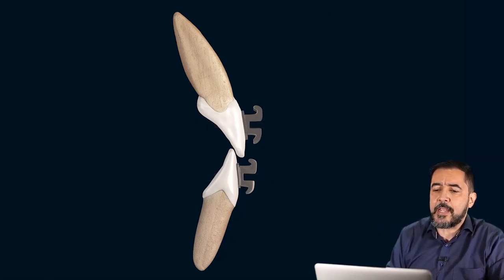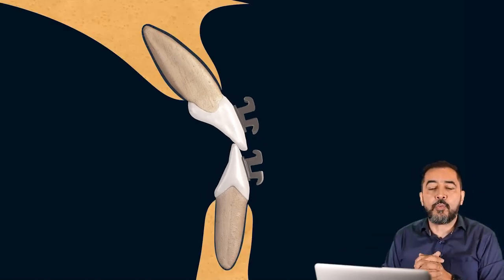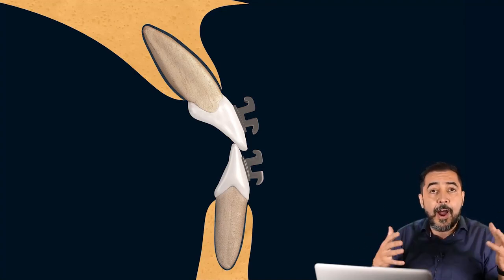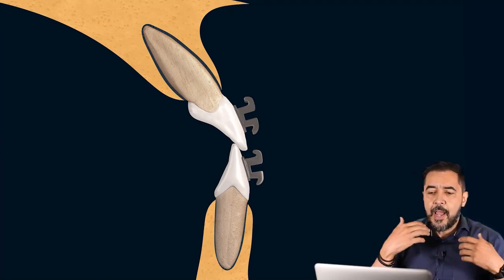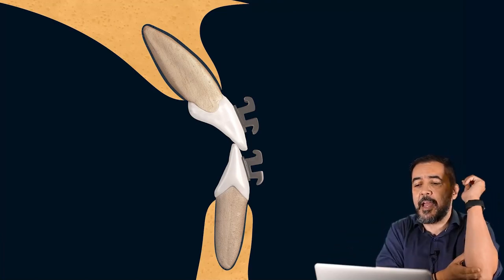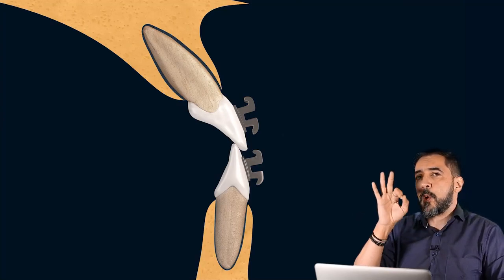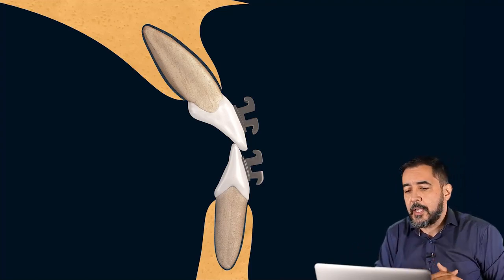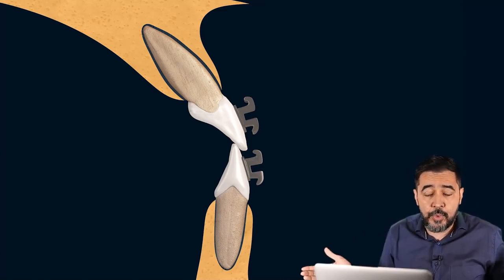Let's think, for example, of a class 3 patient. What is going to happen when I have these compensatory movements that I achieved in this patient during my sequence of arch wires? I was changing my arch wire every time the patient came back to my office, every month, and everything was going smoothly and was very, very good at this point. We are still using round wires here, and we used elastics, and everything was very good, with a beautiful inclination, a beautiful occlusion, compensatory occlusion, of course.